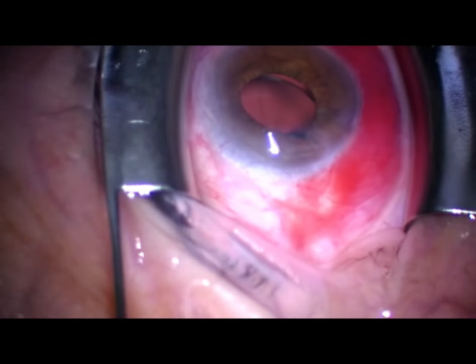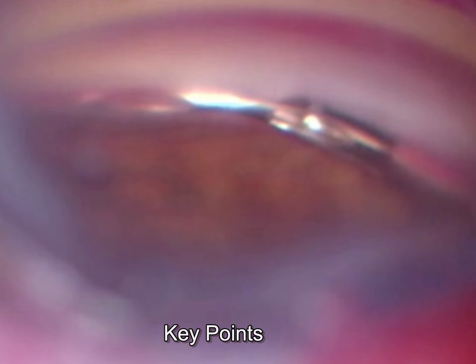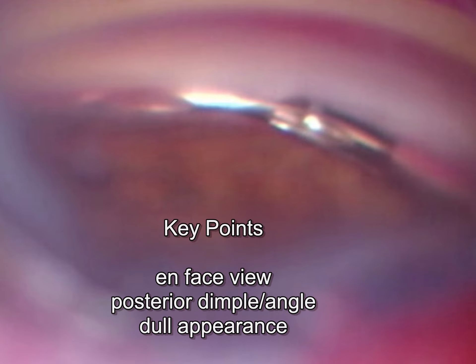Let me do a stop-action and show you what I saw. Notice how shiny the tip is on the first insert. On the second insert, notice there's that dull sheen in front of the device. The first implant is in the meshwork — it's not in the canal. The second one is in the canal. This is a very subtle finding but it's important to recognize, because obviously it will not work if you don't have it in the canal.